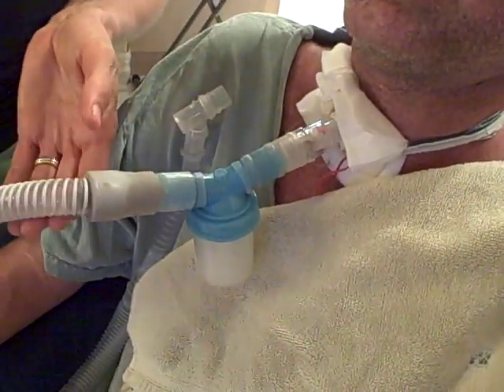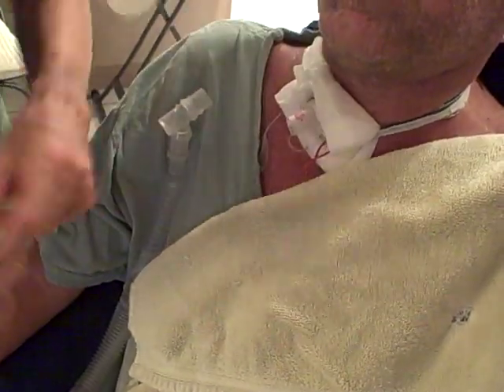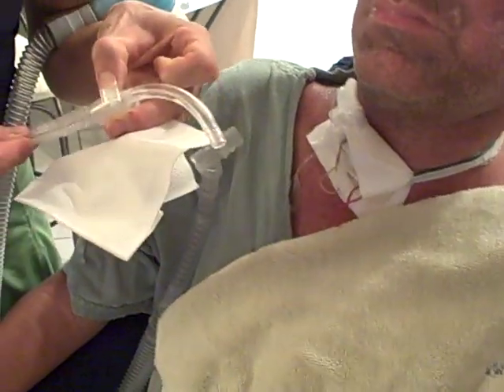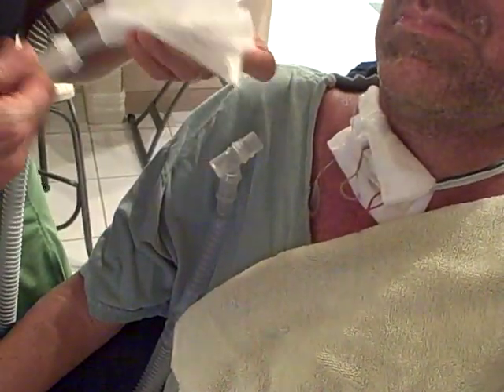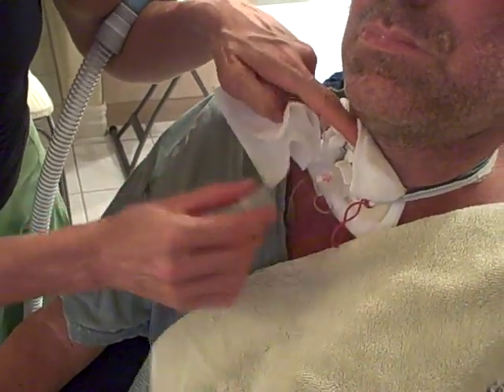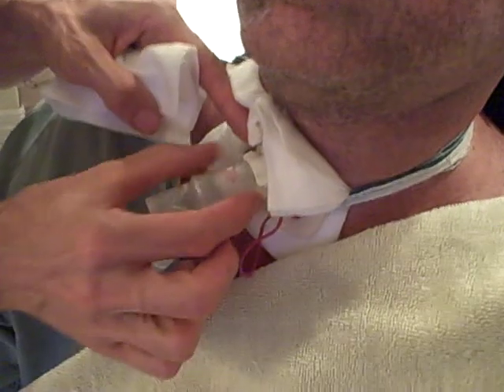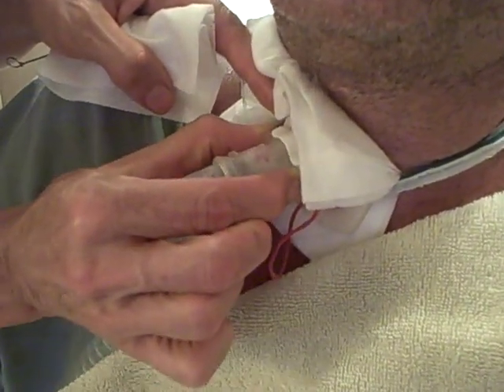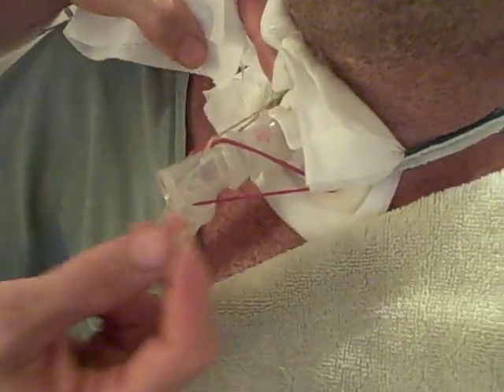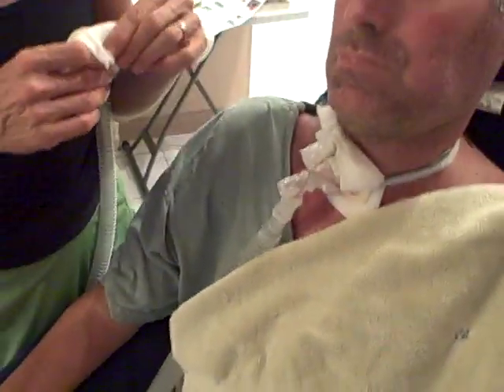Matt will blink when he wants to stop before the seven breaths, and then I just clean the inner cannula out. With his trach, if you look at it, we've hooked up rubber bands because we've had some problems with it slipping out and not hooking on tight. To prevent any accidents we put on two rubber bands and hook it up — and that's the Cough Assist.